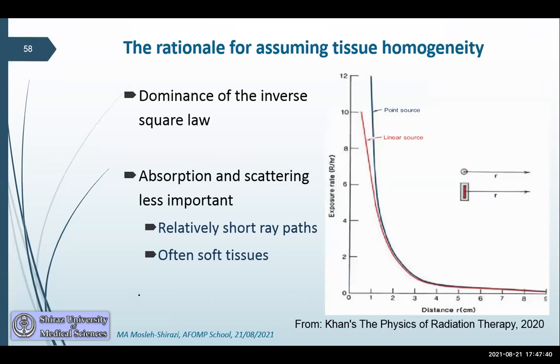Onto dose calculations as my final section. It may be a question, why have centers started using image guidance in terms of dose calculation so late, or why are only model-based calculations being talked about now? This is because of physics, because the dose distribution is almost totally governed by the inverse square law and not by how energetic the gamma rays are and how much they are absorbed and scattered. That's secondary in importance in brachytherapy.